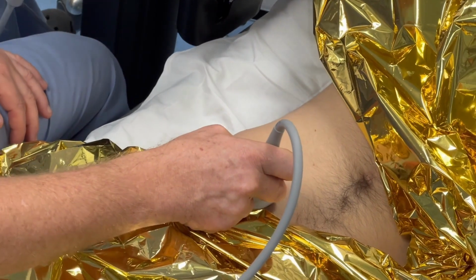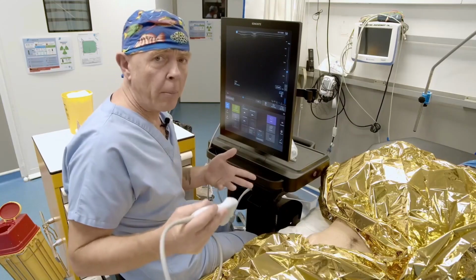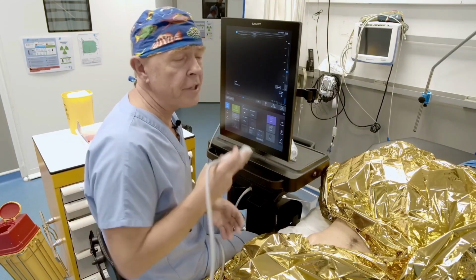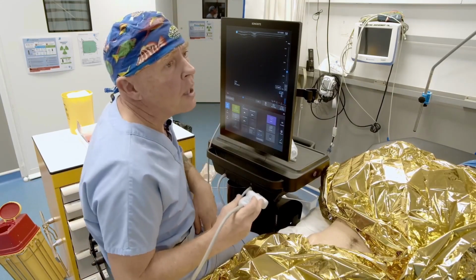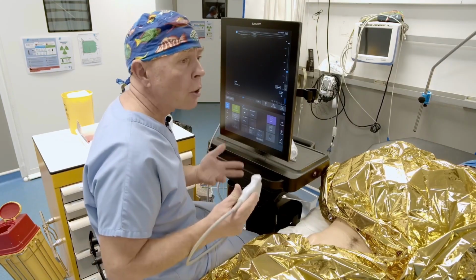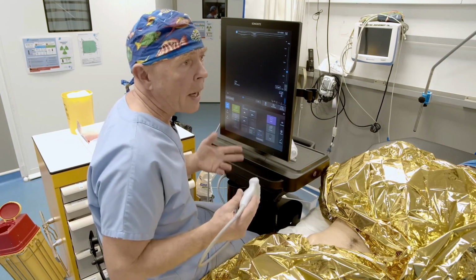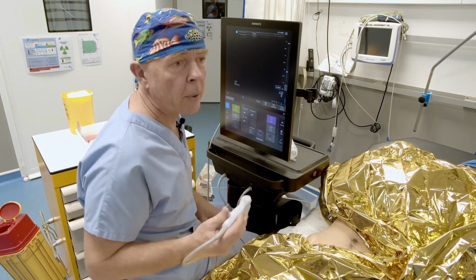So we're going to cover the last 2 blocks. We'll get set up again a bit for the tap block and the paravertebral block. And with that, we'll have finished this workshop covering the 9 blocks. The main ones, namely the 3 blocks for the upper limb, the 3 blocks for the lower limb, and 3 diffusion blocks, which allow you to perform about 95% of your practice in anesthesia.